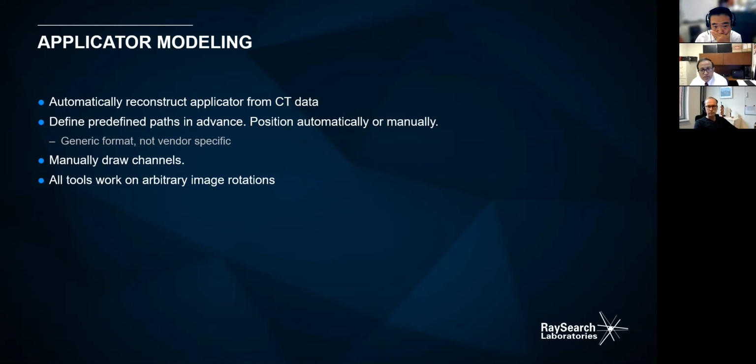Yeah, that is good, but I don't know whether vendor to vendor there is any agreement you need that is beyond our user domain. That's why we don't know that part. That is up to you to negotiate with other vendors whether you can integrate everything into one software. As a user, we are not able to suggest or do anything about that.